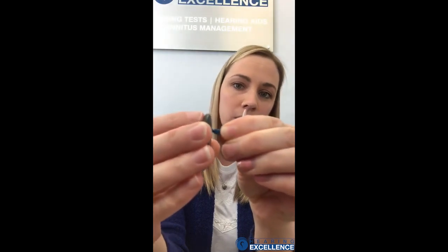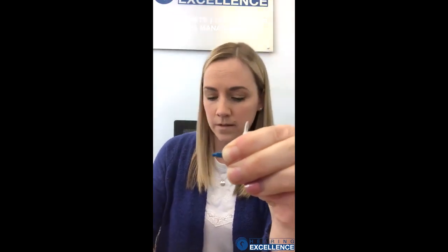So when you're looking at this circular disc, you'll notice there's a garbage can and then a new one. What you want to do is get rid of the old one in that garbage can, pull it out, then go down to the bottom where it says number 2, put in the new one. And that's it. What you'll do next is just find that little dome and wiggle that back on.